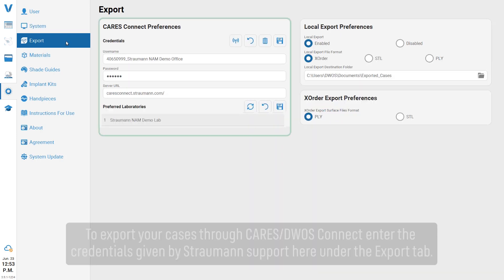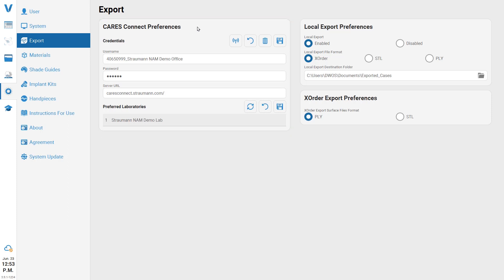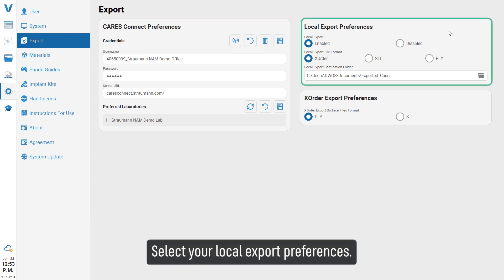To export your cases through CARES or DWOS Connect, enter the credentials given by Straumann support under the export tab. Select your local export preferences.